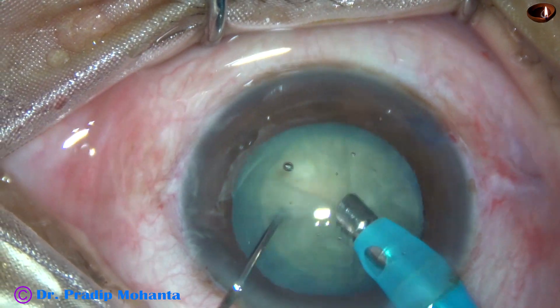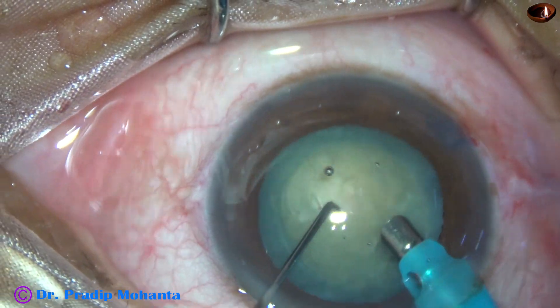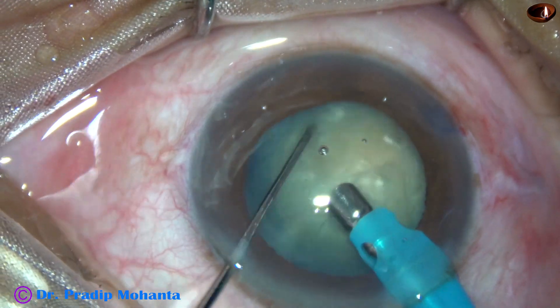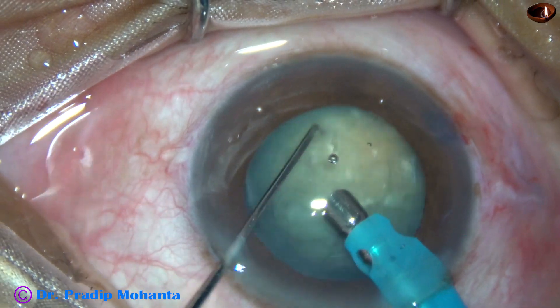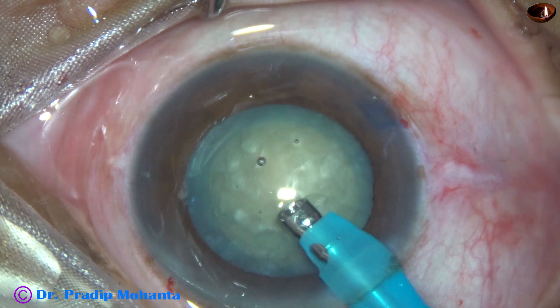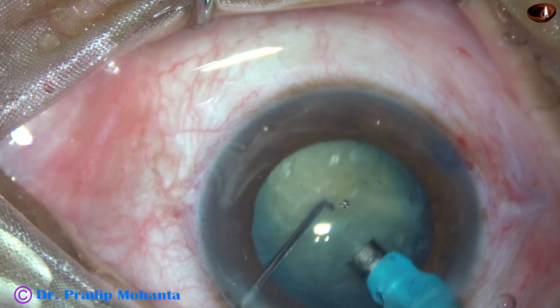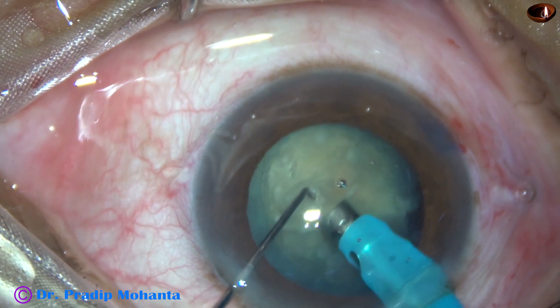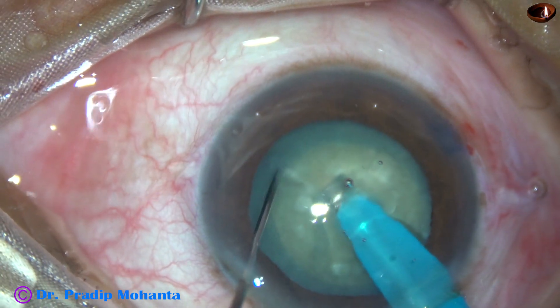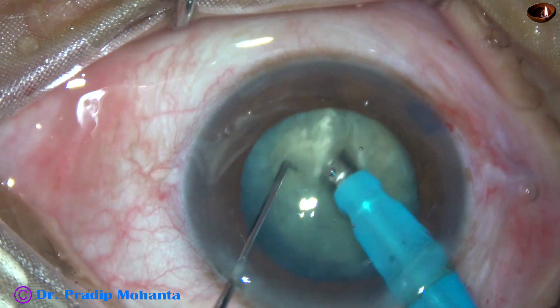Now the phaco needle goes in. Some superficial cortical lens matter is removed. The nucleus is rotated nicely, and the handpiece is turned to make the bevel up. Now watch submarine chop — the tip goes into the substance of the nucleus, moving through it towards the opposite equator. The chopper is used just in front of the phaco needle.